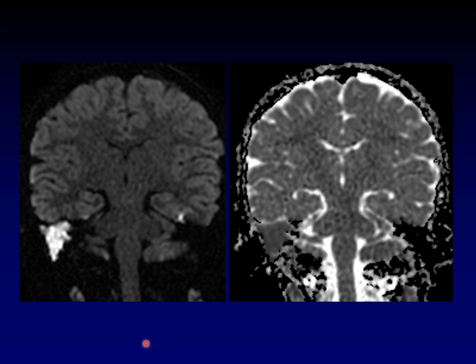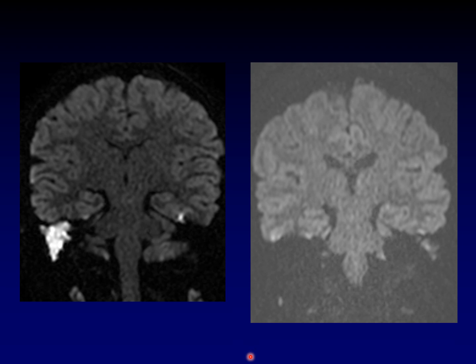Here's the same patient's ADC in case you'd like to see those. So when you're deciding whether a patient has a recurrent cholesteatoma, you're looking for something much brighter than brain — not something that is essentially the same signal as the brain.